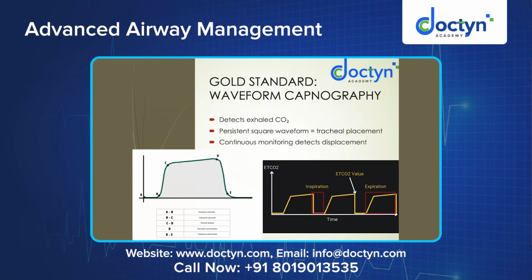One important way to confirm it is waveform capnography, or the end tidal carbon dioxide measurement. There is an apparatus to connect this CO2 monitor to the circuit. It detects the carbon dioxide in the exhaled air. If the tube is in the esophagus, there will be no continuous supply of carbon dioxide, so there will be no continuous CO2. There might be an initial spike, but then it will come down. That is the sign of esophageal placement.